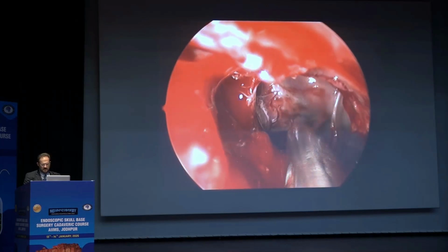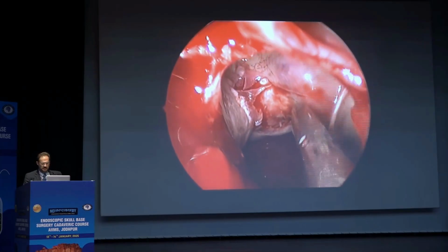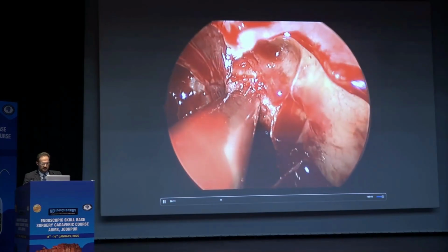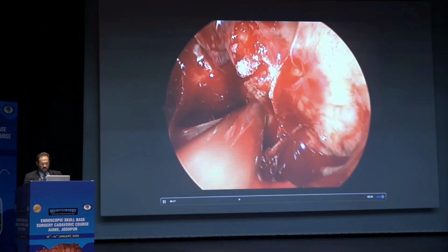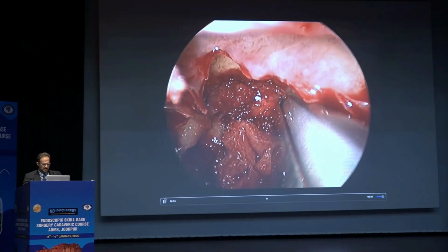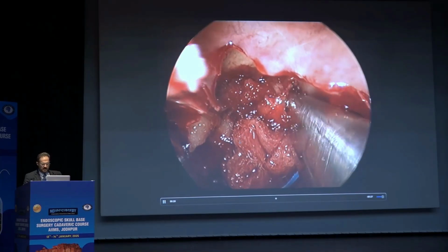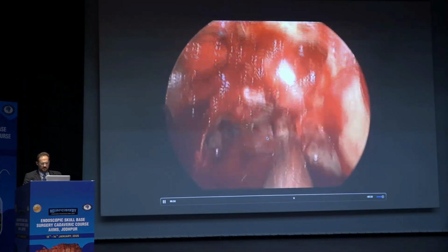Now, this is my favorite video because it shows other problems as well. This was a small pituitary adenoma, and in this case it's a problem related to anatomy as well. The surgeon is exposing, and again, lack of exposure is one of the issues here. If you look here, the sella is down there, but the surgeon decided to expose the carotid artery. As you can see, it covered the normal anatomy, so the surgeon got disoriented. So don't cover much, it's very important.